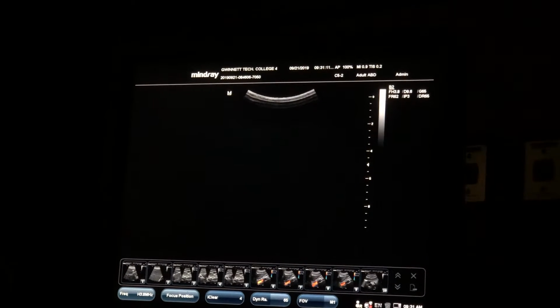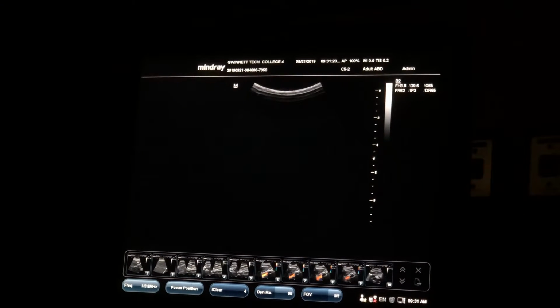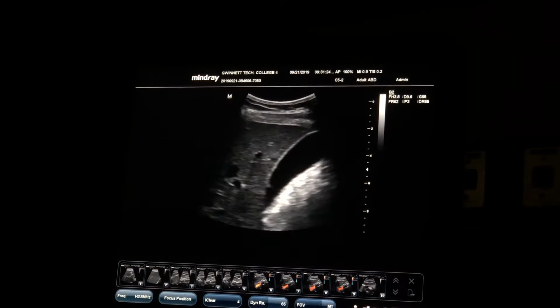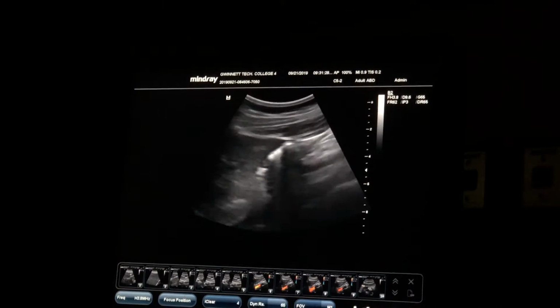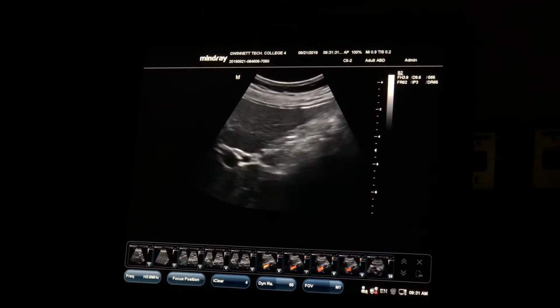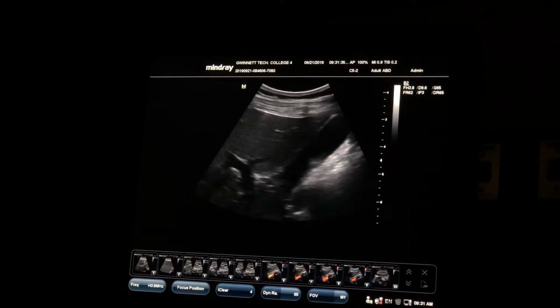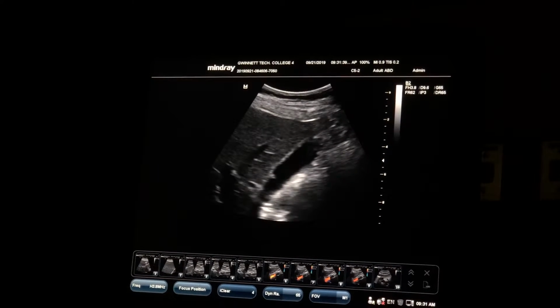Every time you come from a different position, you're asking me a new question. What does it look like from coronal? What does it look like from over here? Just a little bit. What if I just come up one rib space and angle down under that rib space? Could I see it there? Yeah, do that. You have every single rib space as an opportunity to look from a different perspective. So that you're not, now I saw it from over here, maybe that deep breath and hold. Maybe this oblique scan plane wasn't my best way to see it. Maybe I'm gonna come coronal and I can see it better from here.